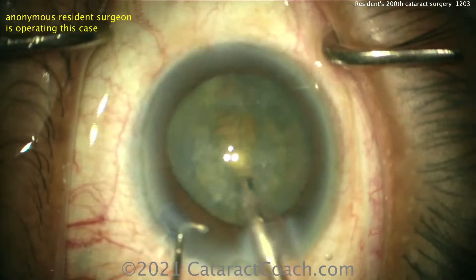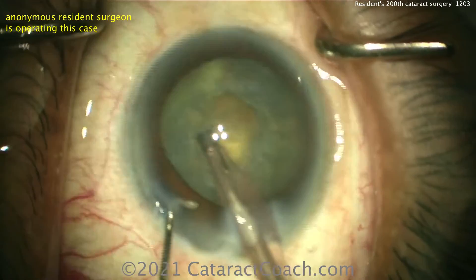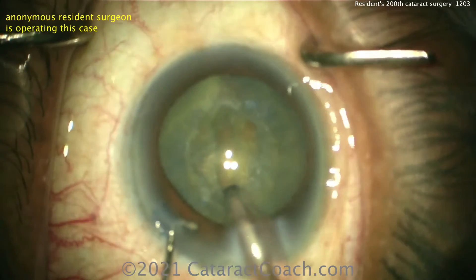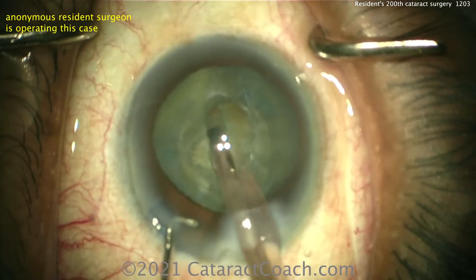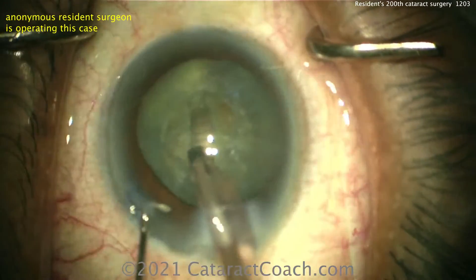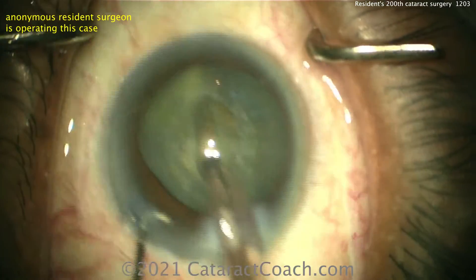Let's see the technique here — cleaning up some anterior cortical material, bevel up, so we're going to do a groove. There's a pretty good groove down the middle, staying within the confines of the capsulorhexis initially, and then once you get deeper you can go under the rhexis edge. That looks like a pretty reasonable groove — you may want to widen it up a little bit to have more working room.